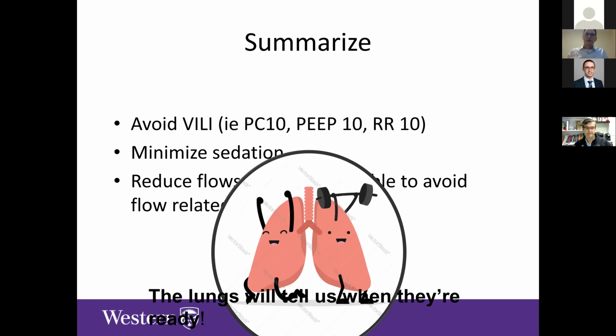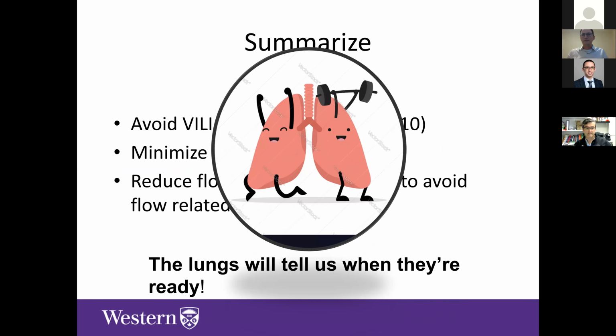And then the final principle is that the lungs will tell us when they're ready. So if you just left them on 10, 10, and 10, as compliance increases, you'll see tidal volumes come up, and they'll let you know that they're ready. But the problem is, as humans and physicians and healthcare teams, we're impatient, and that may be 2 months from now. And that's what the rest of the world is seeing, that some of these ECMO patients for COVID, it's taking months for their lungs to recover, but they do recover. But it's just very abnormal for us to be dealing with this type of patient on ECMO.